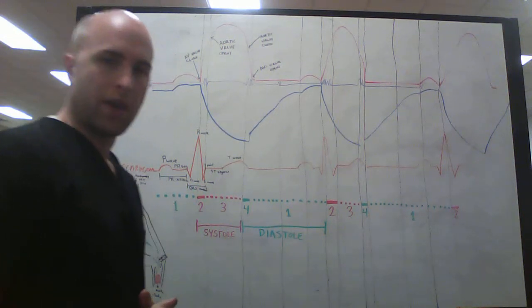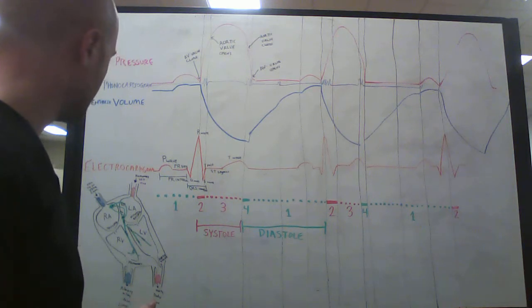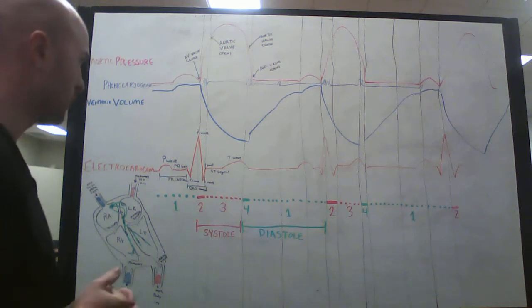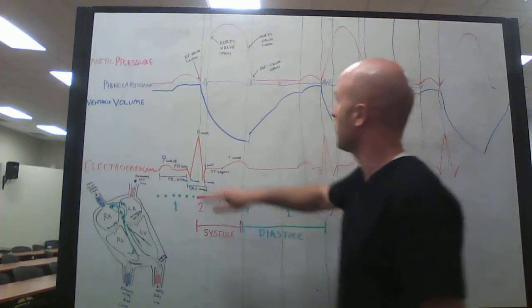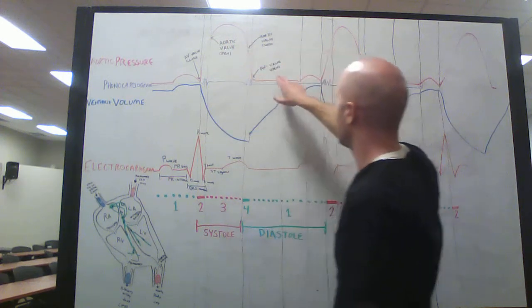This is an EKG lecture following some of the things that occur in the heart during the different phases and following the actual electrocardiogram readout. Starting out, just to explain what we're seeing here, this top red line is a marker of aortic pressure.